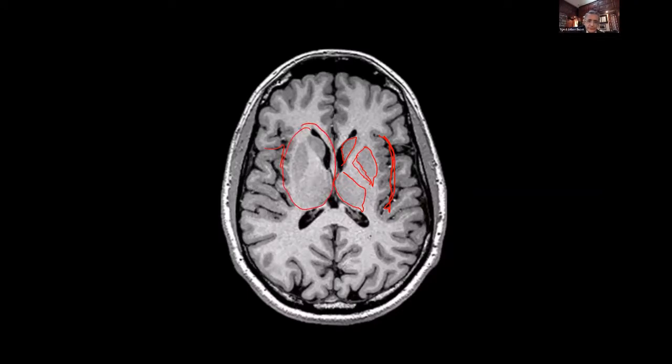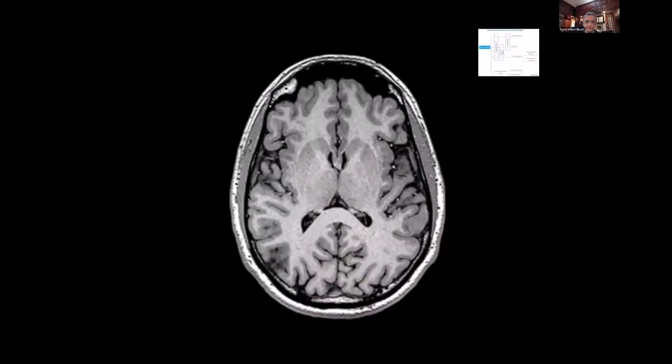This, to align oneself always. This is the atrium. Why do I say atrium? Because I still see the choroid plexus in here, and then the occipital horn will go like that. And in this, you can now see the central sulcus. It's very difficult to distinguish the central sulcus over here. But the parieto occipital fissure you can see, and that's more like an X shape like this. You can see it over here. The calcarine sulcus is deep. You can see it over here. Same thing, right? Now this is a little higher up. Okay, so remember this structure.